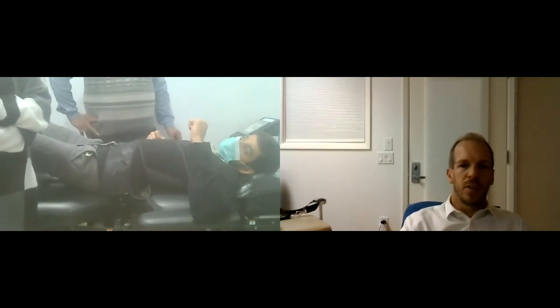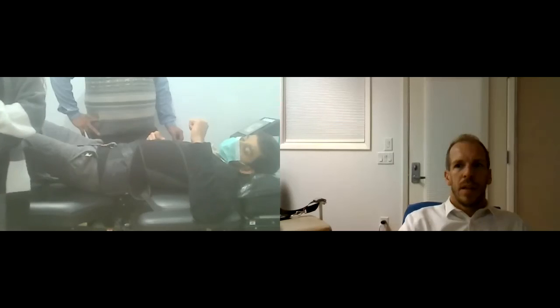Sometimes, because this is very slow and very gentle, patients will say, I'm not feeling very much, and that's perfectly okay. You want to reassure the patient that this is a very gentle, very subtle treatment, and that's okay.